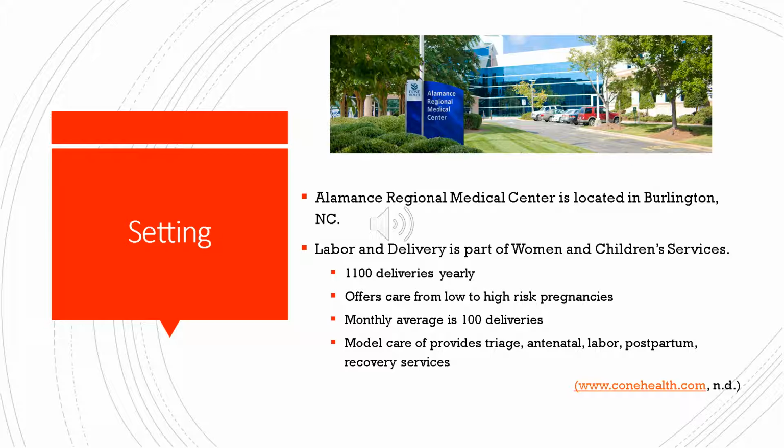Using the 4 components that affect hemolysis, further examination of the process and products were conducted. All of the blood bank specimens are collected when initiating an IV catheter in labor and delivery. The antecubital space is rarely used, as this site is challenging for patients in labor in regards to position.